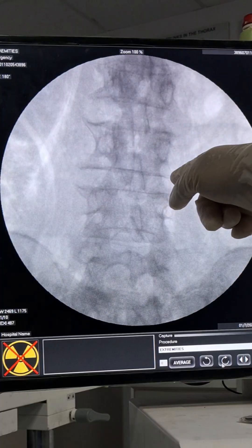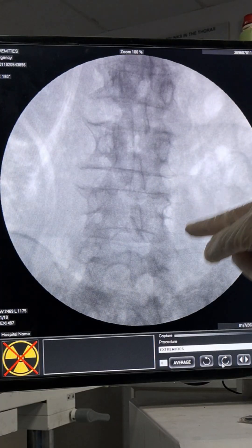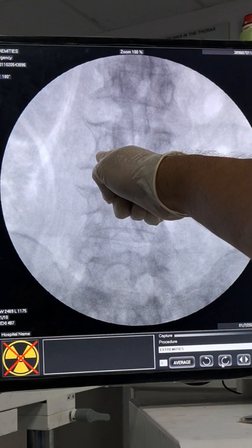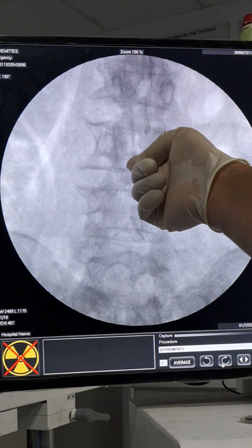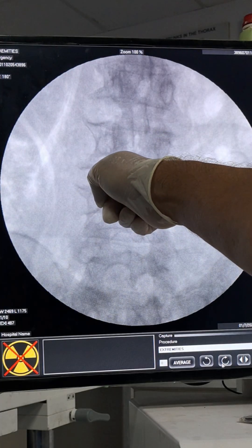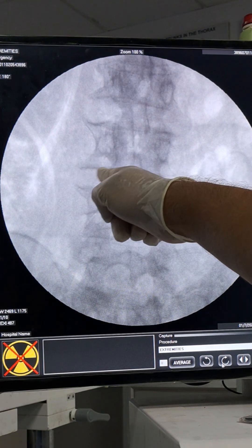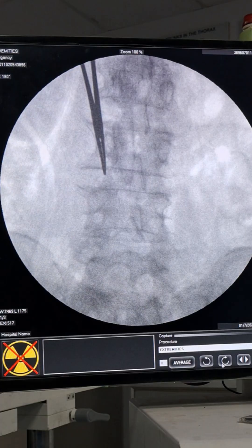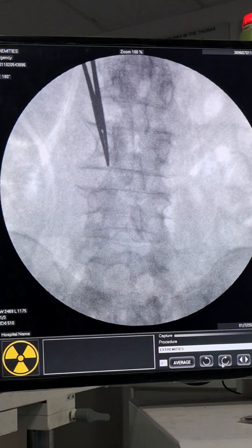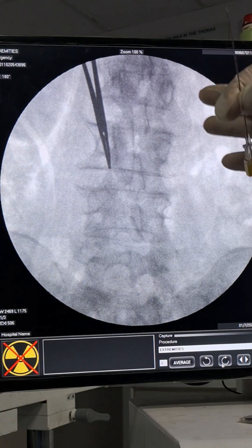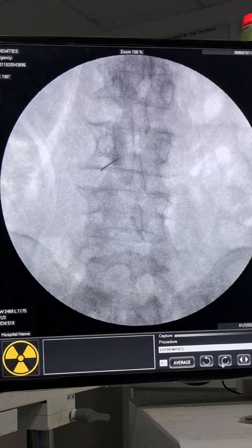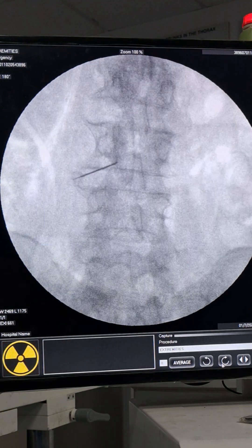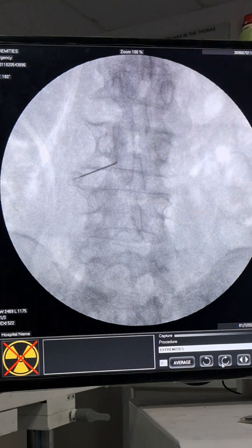For how much oblique: for transforaminal epidural, take enough oblique so the outer border of the pedicle touches the outer border of the vertebra, then come below the pedicle. Taking that much oblique, my target is to hit the pars. I will hit the pars so that at that oblique angle I can enter into the foramen. I can now see the needle is touching the pars in oblique view.